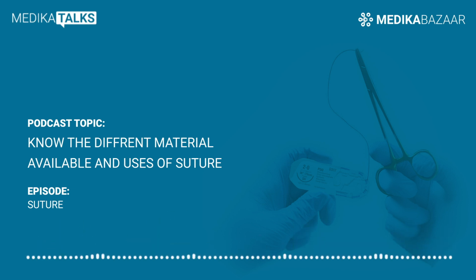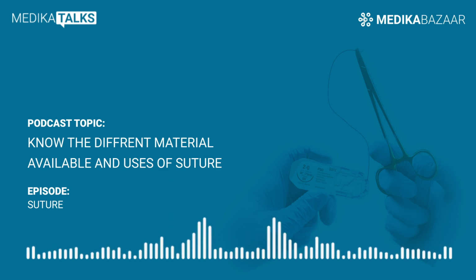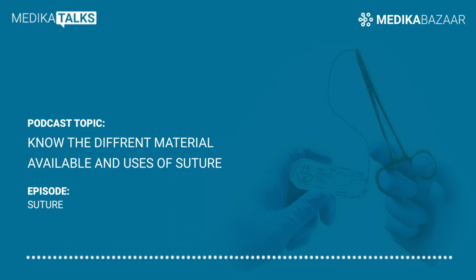Non absorbable sutures are used to provide long term tissue support, remaining walled off by the body's inflammatory process until removed manually if required. These uses include tissues that heal slowly, such as fascia or tendons, closure of the abdominal wall, or vascular anastomoses. Suture materials can be further categorized by their raw origin.